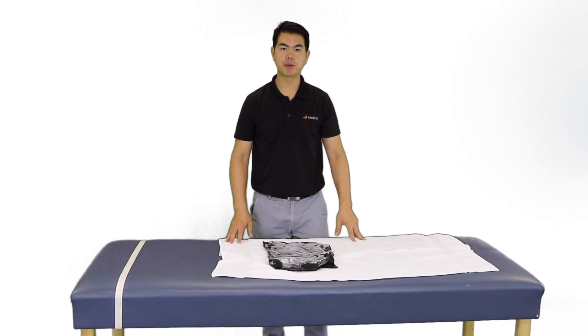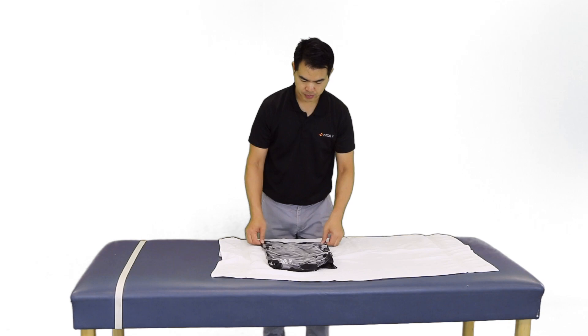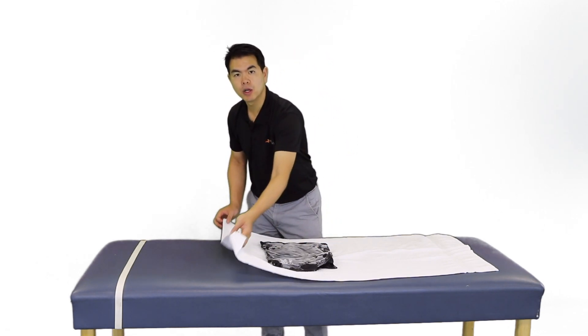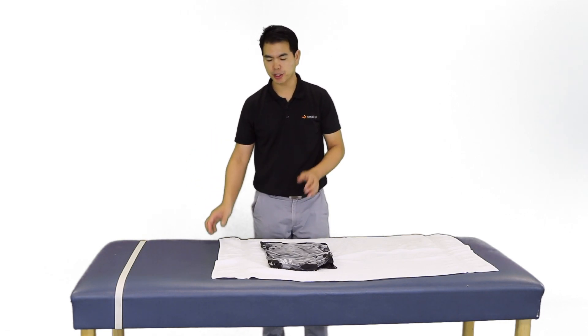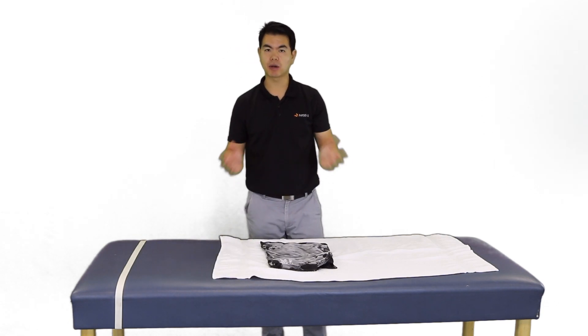For the application of cryotherapy, we can use crushed ice or a cold gel pack. We will typically, for the patient's comfort, use a thin towel. Depending on the rate of temperature reduction that you want, you can add moisture or dampen the towel, or you can use a dry towel.